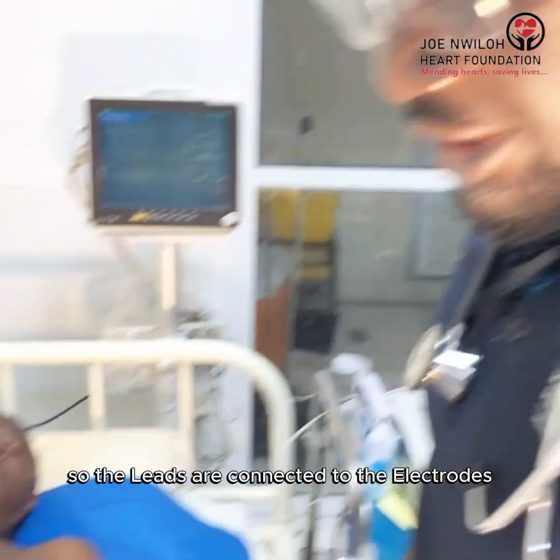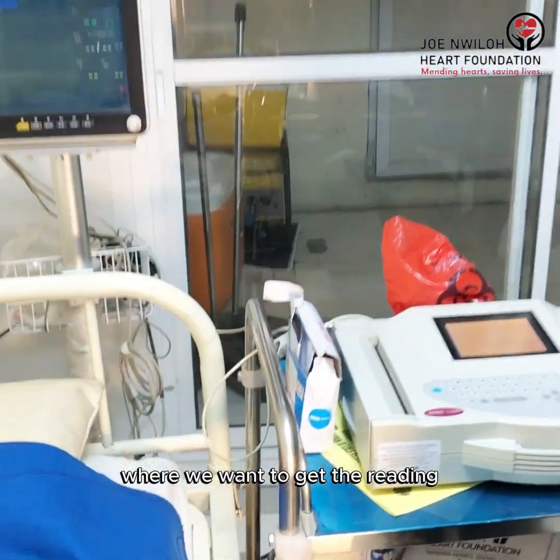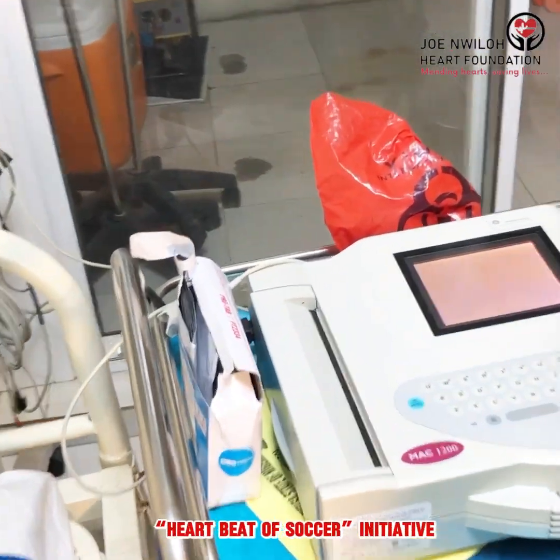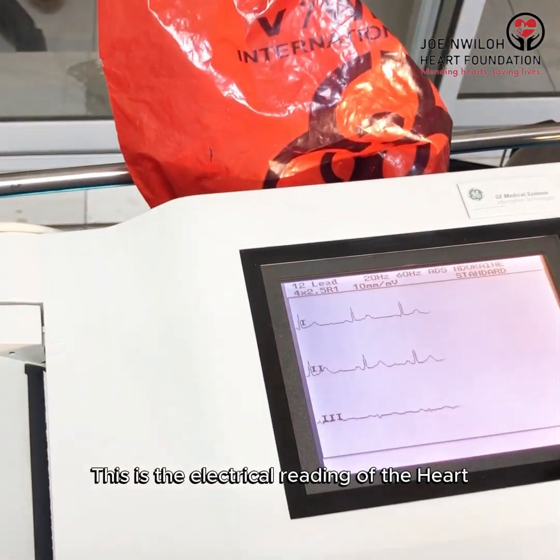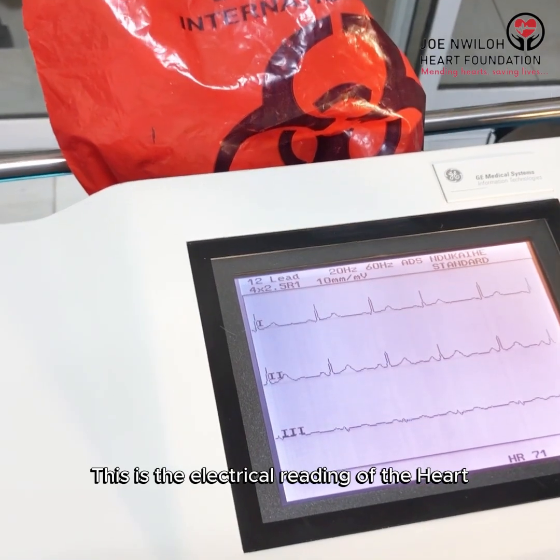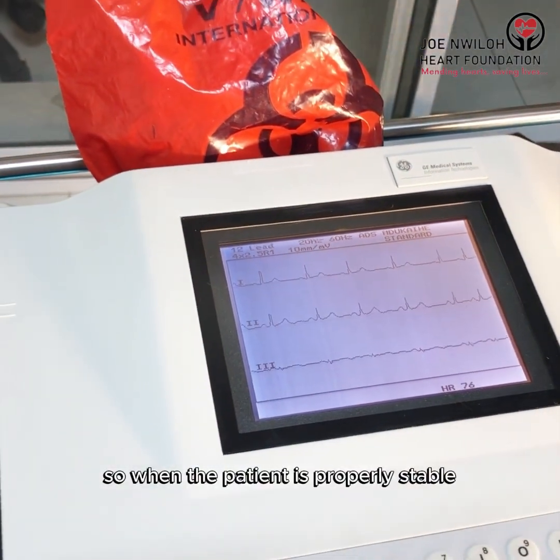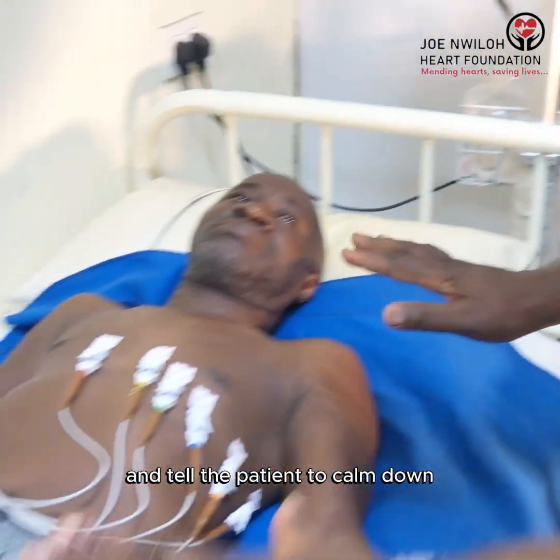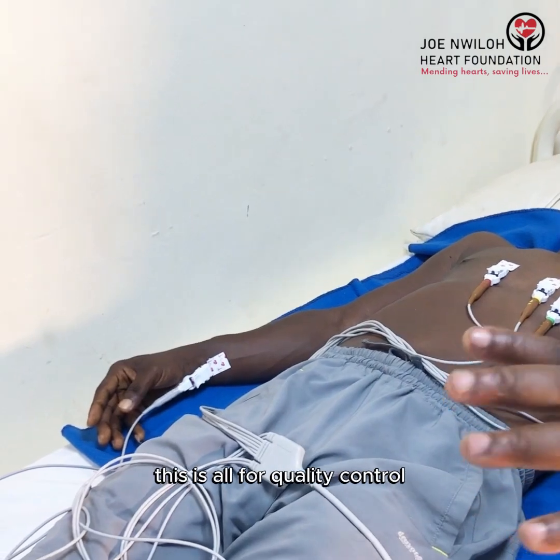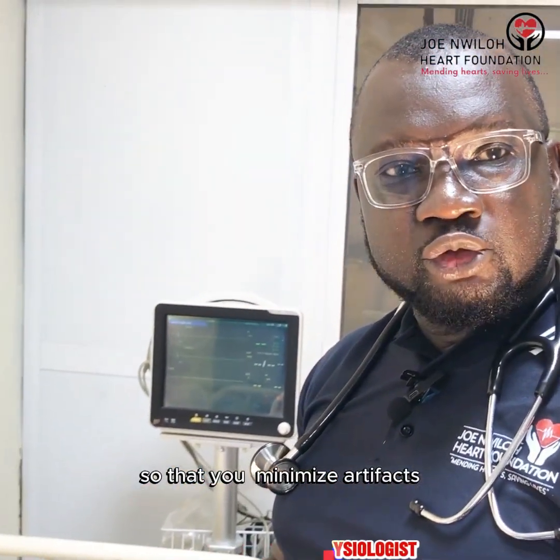So the leads are connected to the electrodes. So we'll move over to the machine where we want to get the reading. So as you can see, you start seeing the reading moving. This is the electrical reading of the heart. You understand? So when the patient is properly stable, you go back to the patient and tell the patient to calm down. It's not going to shock you. This is what we call quality control. The patient has to calm down so that you minimize artifacts.